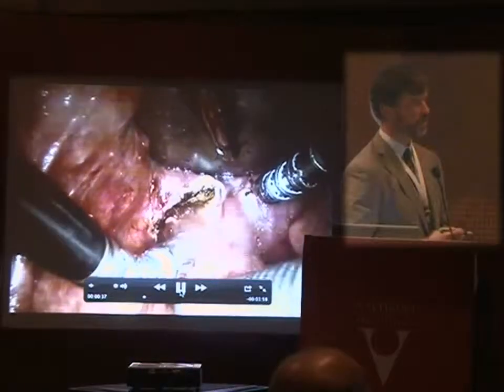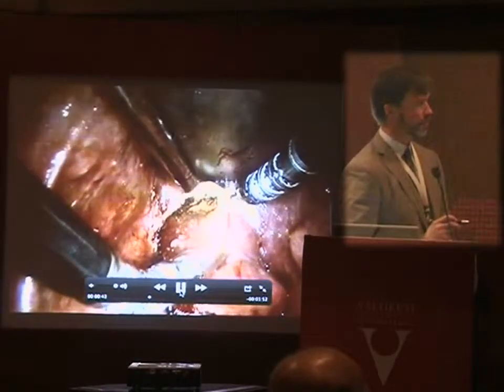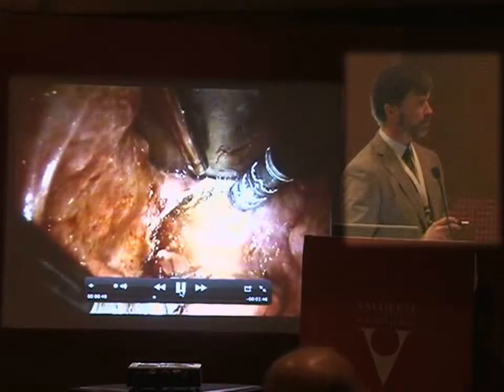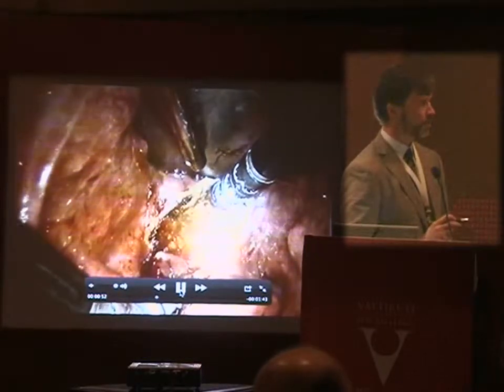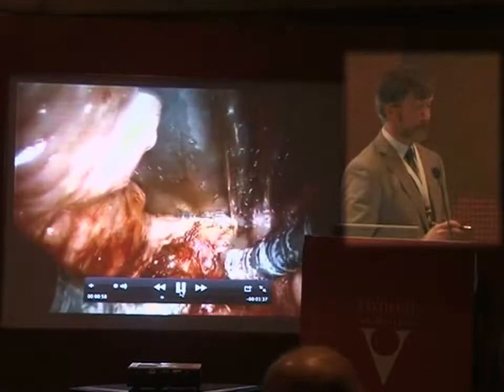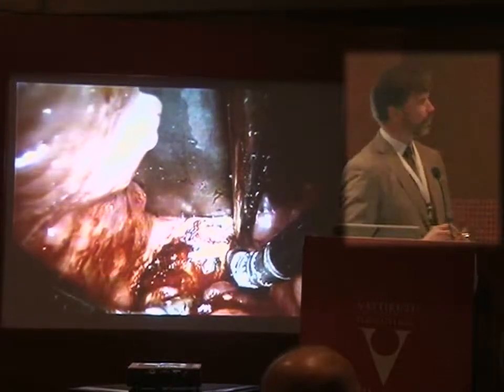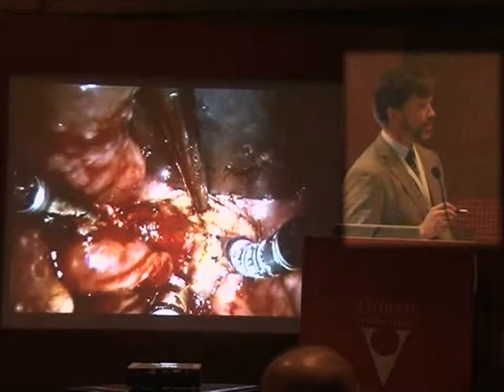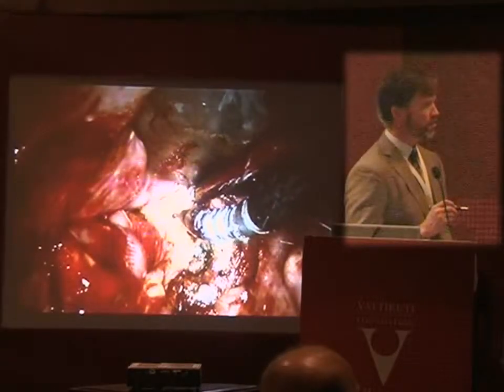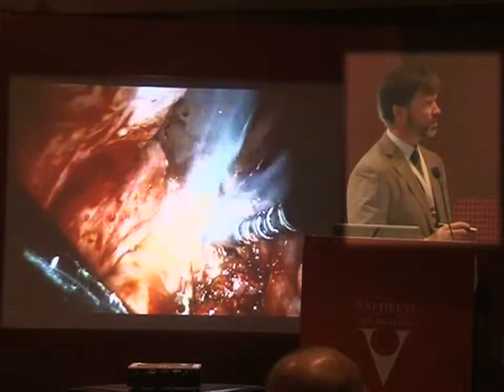I like to perform an en bloc resection, so unlike the TLM procedure where you only have really one instrument in your field, we have four instruments in the field. My assistant has a suction and a retractor, and I have a Maryland dissector. The epiglottis is being pushed down and I'm using the LESA laser, which is a near-contact fiber with good hemostasis and coagulation qualities but very little heat generation, so edema is minimal.